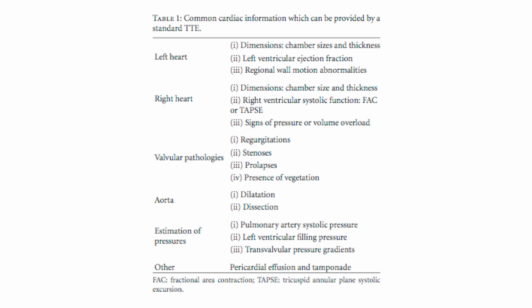And then other things that we've talked about before, the estimation of pulmonary artery systolic pressure from tricuspid regurgitation velocity, and also looking at some of the other pathologies, pericardial effusions and tamponade.